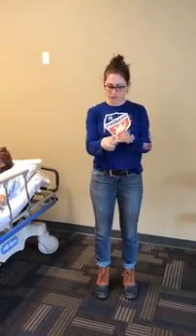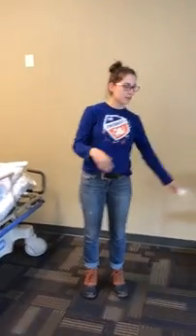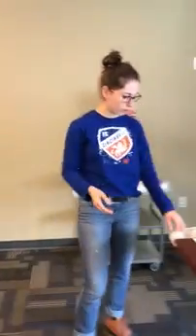So I'll pull them off, and then dispose of them, and then perform hand hygiene, and I would document and chart the patient's name, the date, and what I did, and the integrity of her skin and all that. And so that is how you apply the restraints.